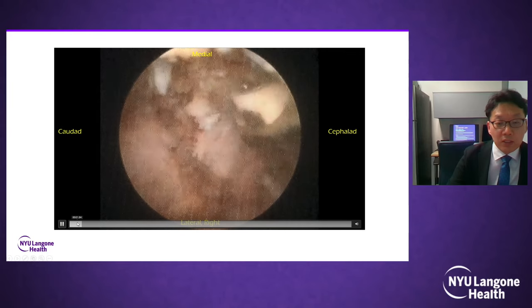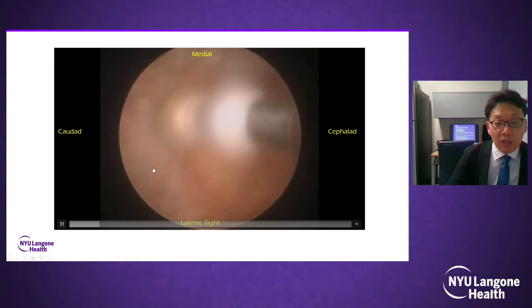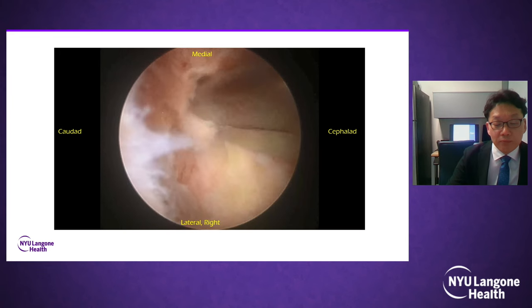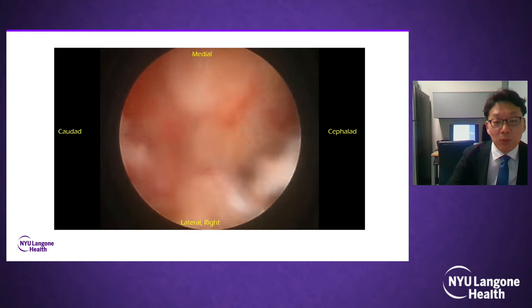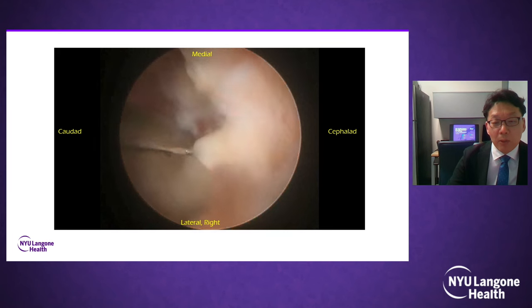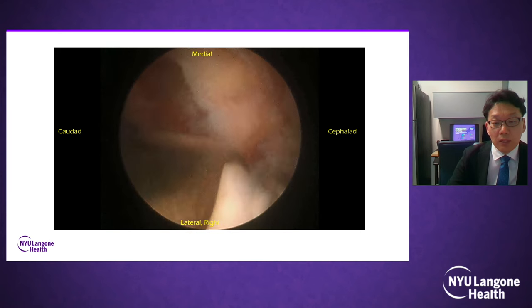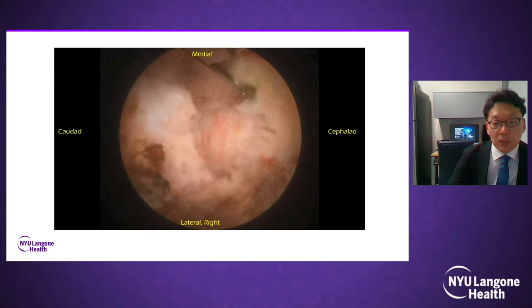Unlike foraminal stenosis, the laminectomy is started from the lamina, not at the V point. Upper and lower lamina were drilled out. Sorry for the poor quality of the video. Central decompression was done and ligamentum flavum was removed. After that, you can see the central spinal cord.